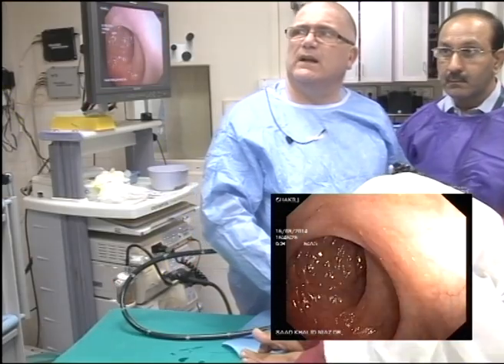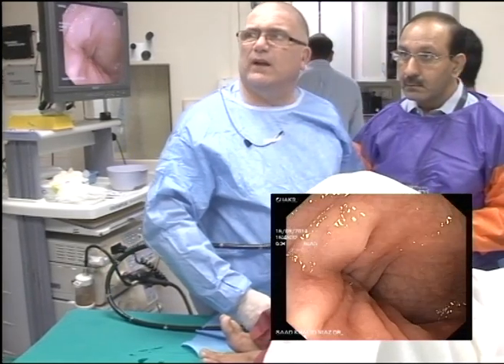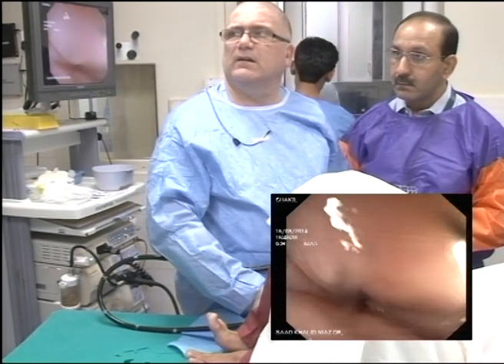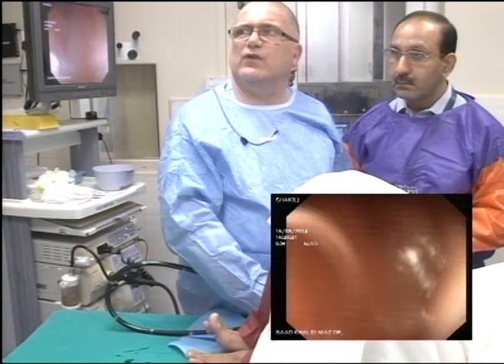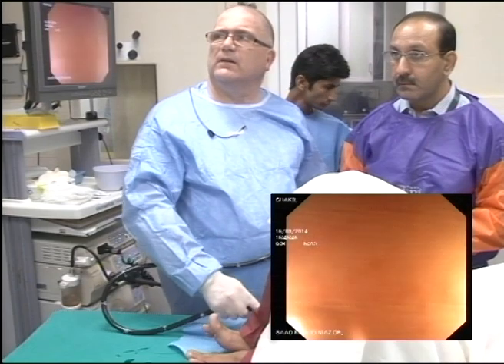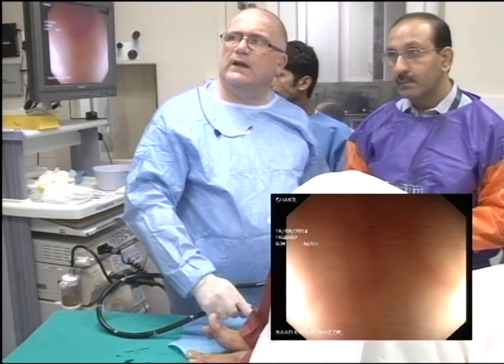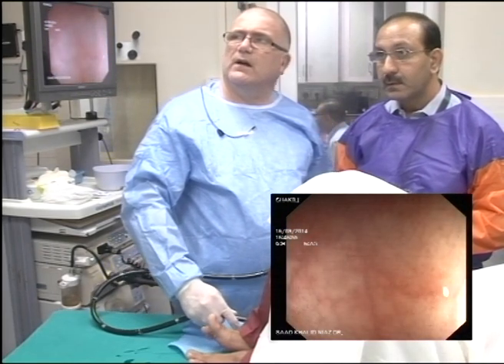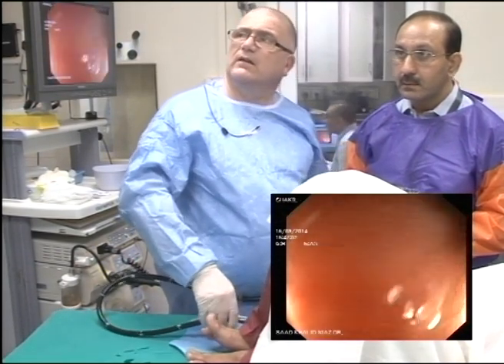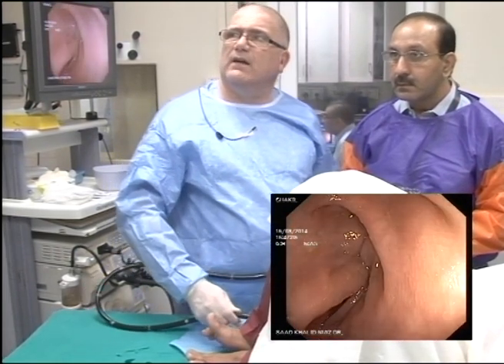And now if you look again, the scope looking back up at 12 o'clock. Alright? And then we go here. And I slow down to what's happening. I'm just looking at his eyes. And we just slow it down. And now we see where it wants to go. The scope wants to go. And if we look again, as the scope comes back, see where it's shiny, see where it's dark. And that's the side you want to go to. For some reason there's a bit of air trapped up above.